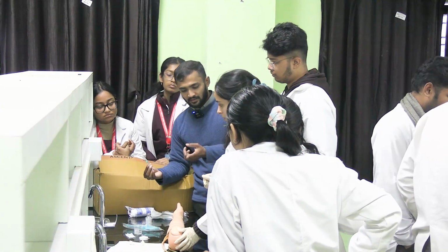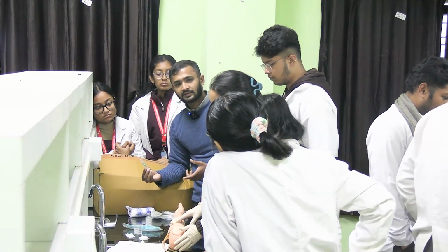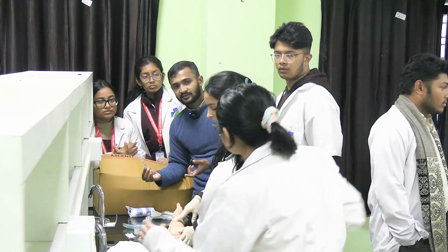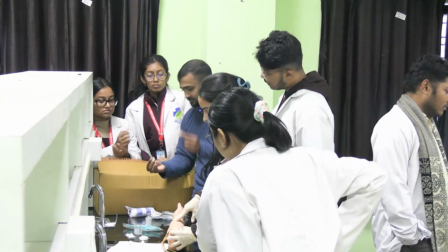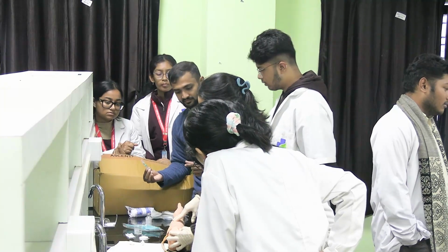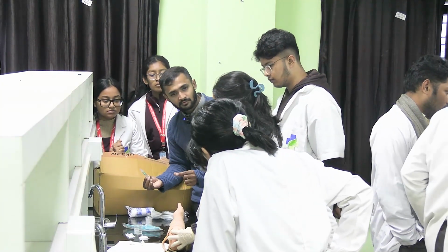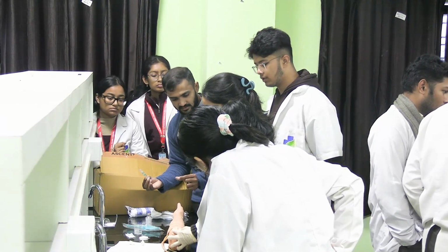Then what is the procedure for SC? What is the technique here? 45 degrees, this is the degree. What is the technique? It is the lifted skin technique, isn't it? You have to give it on lifted skin. So you have to pinch. The distance should be around 1 inch. You have to pinch it little lightly.